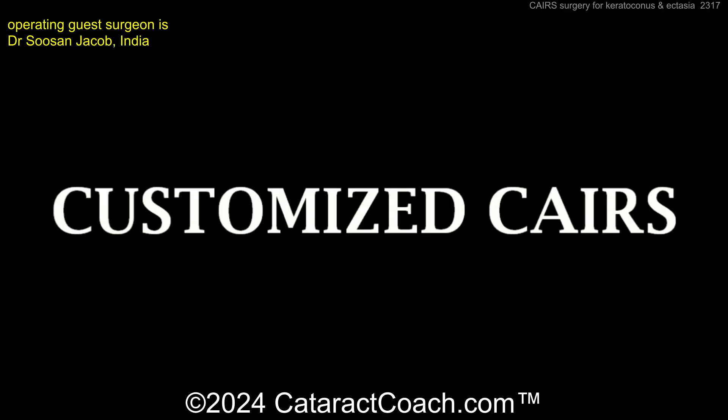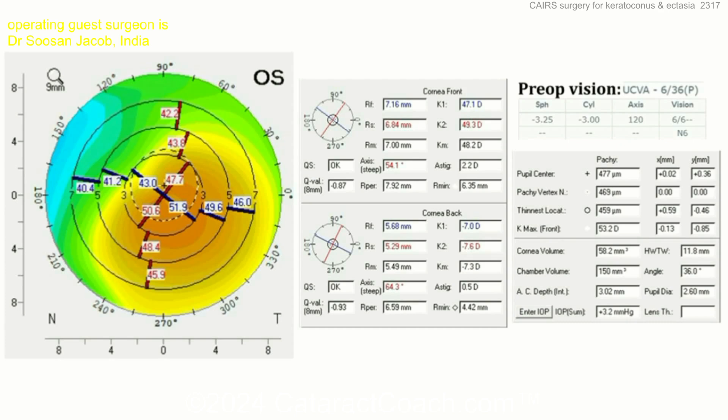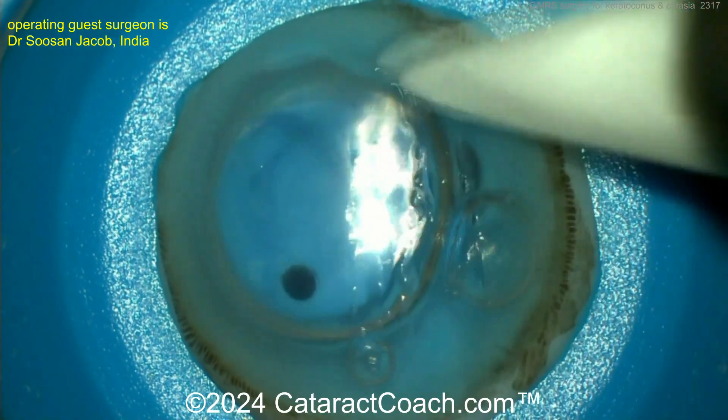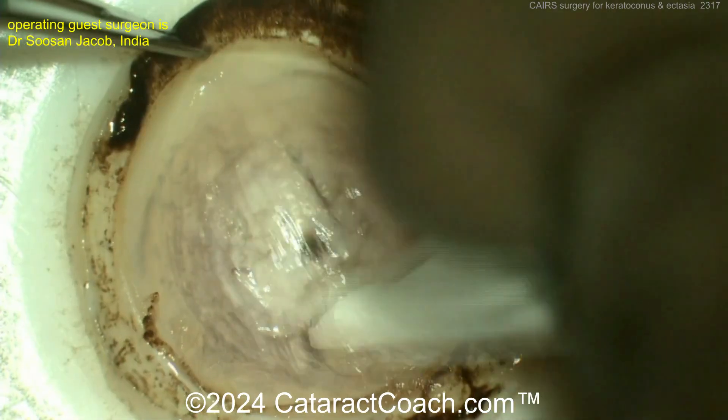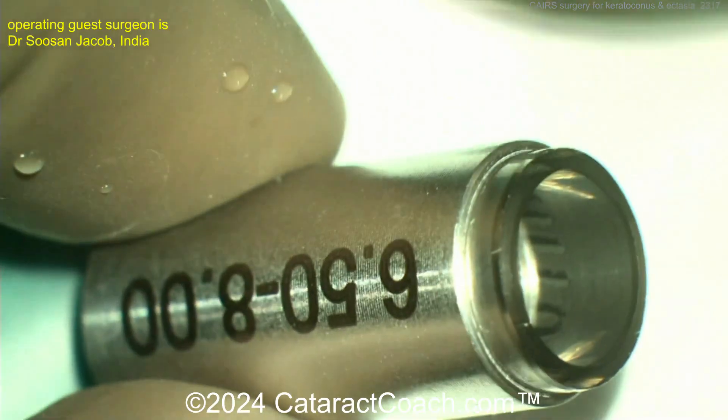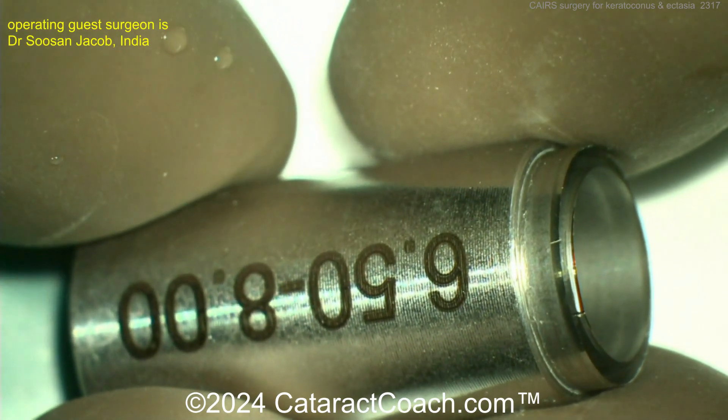Customized CAIRS. Let's look through this concept. Here's a patient with keratoconus — you can see that big cone shape and terrible pre-op vision: 20 out of 200. There's the donor tissue. Taking off the endothelium and the epithelium — you just want the stroma.